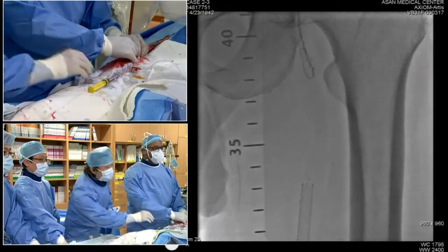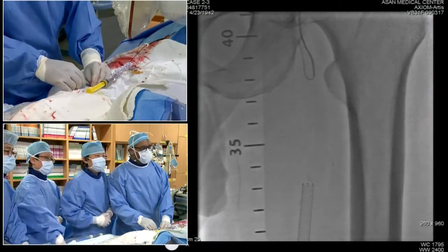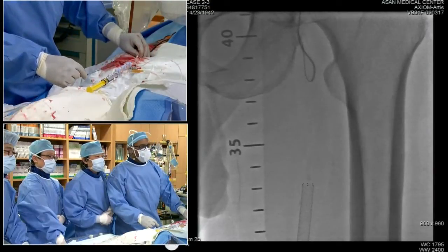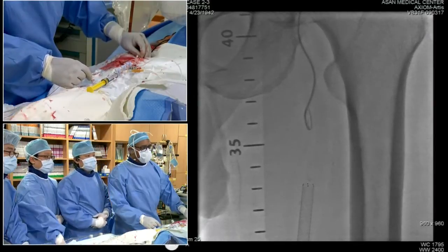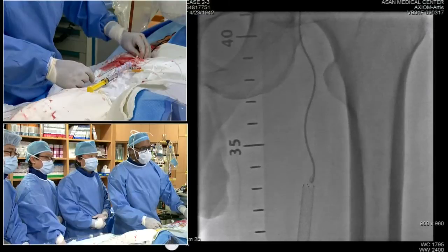We really have no idea whether that stent was true lumen or false lumen when it was implanted. So we're using basically, again, the standard CTO technique and trying to get into a different plane here. This looks a little bit more favorable.